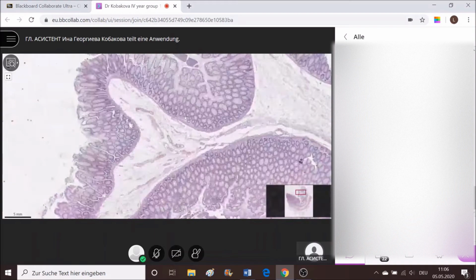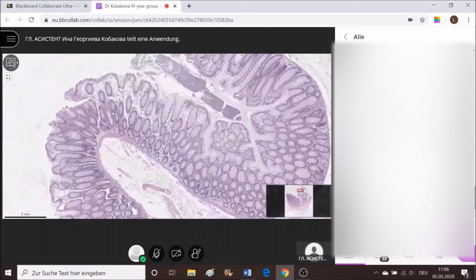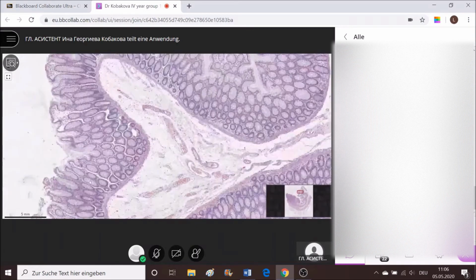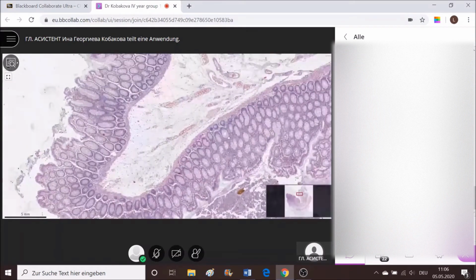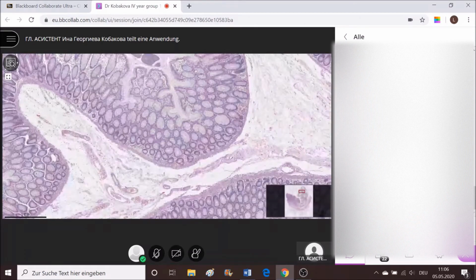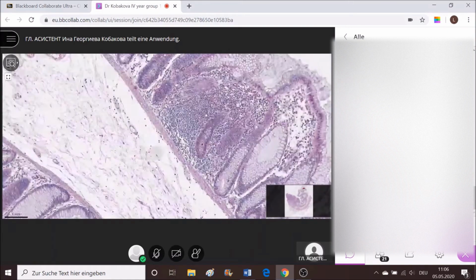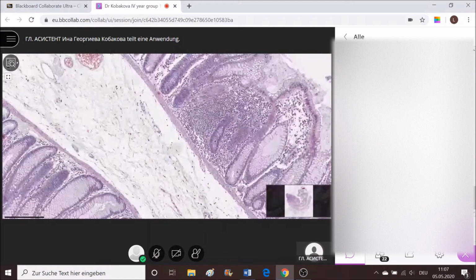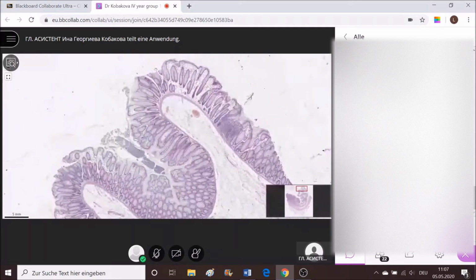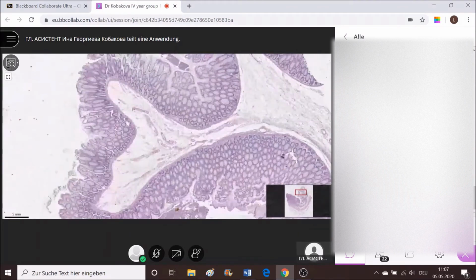There's a small portion of inflammatory infiltrate here in between the glands, which is actually pretty normal to exist. Even if we observe some lymphatic follicles, as you know, this is an organ which is rich in follicles. This one is even trying to make a germinal center. It's pretty much normal here. We see lighter fields of glands, no dysplastic changes, simply fine.